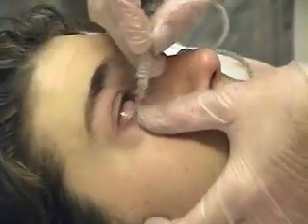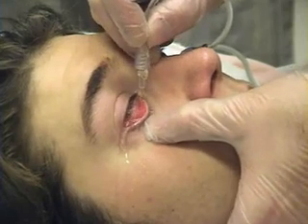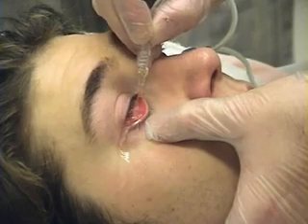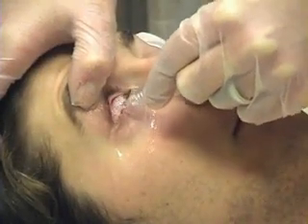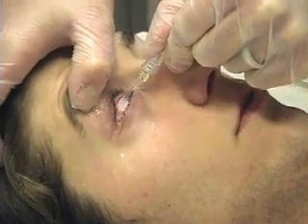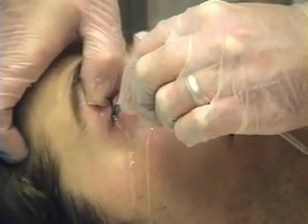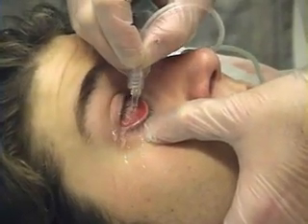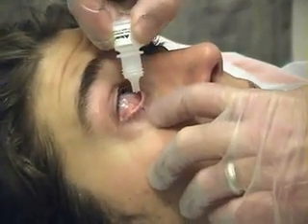Open the wheel clamp on the intravenous tubing and begin to irrigate the eye. Hold the tubing several centimeters above the eye. Direct the flow to all portions of the eye, including both the inferior and superior fornices and the cornea. The duration of irrigation will vary according to the clinical scenario and must continue until the pH is normalized. In many cases, 15 to 20 minutes of irrigation are required and several liters of saline is used.